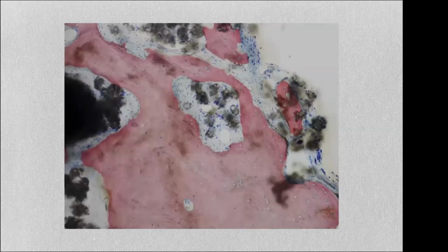And so continuing on to the other side, this again is an area in the graft just above the level of the autogenous bone or native bone. There's a close-up of it with the different staining. Incidentally, the stain here shows the bone with this kind of pink fuchsia color. And these are forming new bone, turning over bone. You see the growth rings.